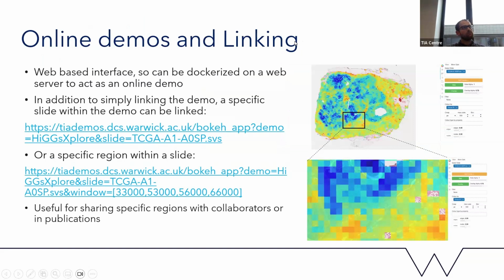So as I said, this tool, because it's a web-based UI, can be dockerized into a web-based demo, to act as either an online demo that you can share with collaborators, or that you can put online as a paired resource with a publication to allow people to interactively explore whatever model you're discussing in your publication.